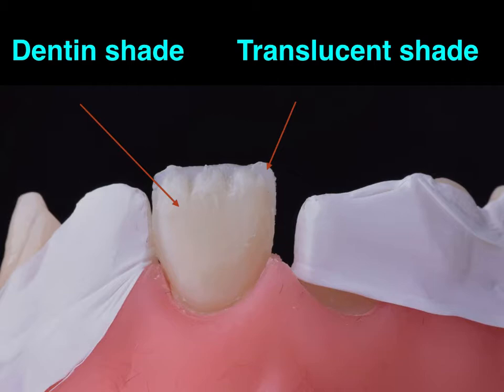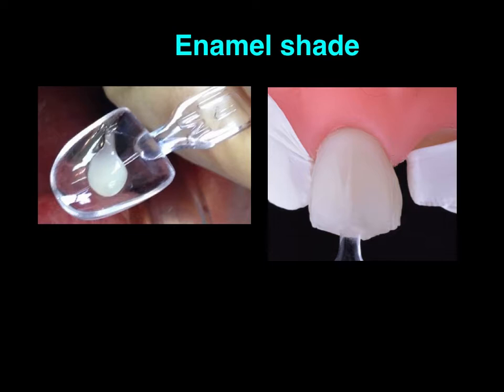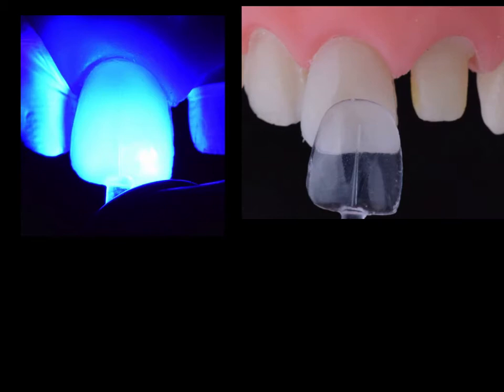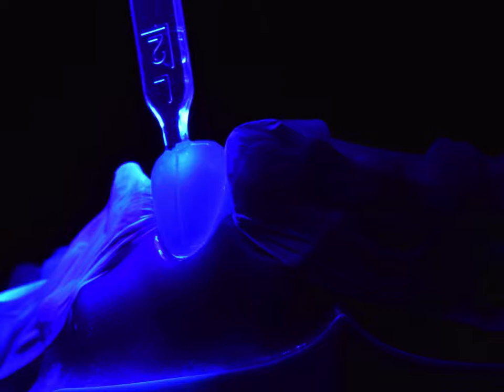At this stage, you will press the Uveneer. You cure and you are ready for the third layer, which is the enamel shade. You can use either flowable or packable enamel shade. You press onto the two layers that you created already and you cure and remove it. Now we're doing the second tooth, it was the lateral, and now we are going to do the central. You can even do temporary crowns with Uveneer.